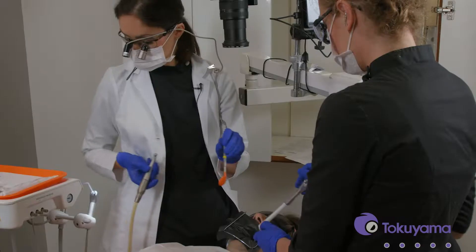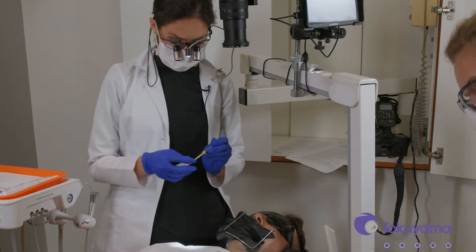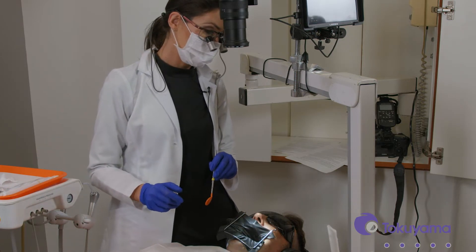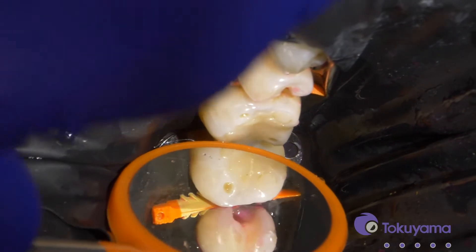We're going to apply the Caries Dye — that's going to help us pop out any remaining caries. There is some staining there, so I just want to make sure it's decaying and not just a stained tooth. We're just going to rub this for a few seconds and then rinse that out. It's just a cavity dye, Caries Dye. It's actually not too bad. Let's do a little bit more.